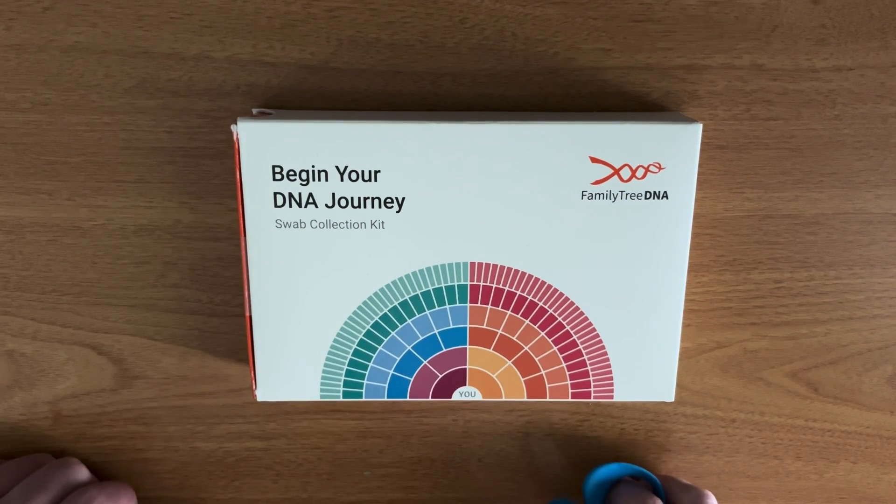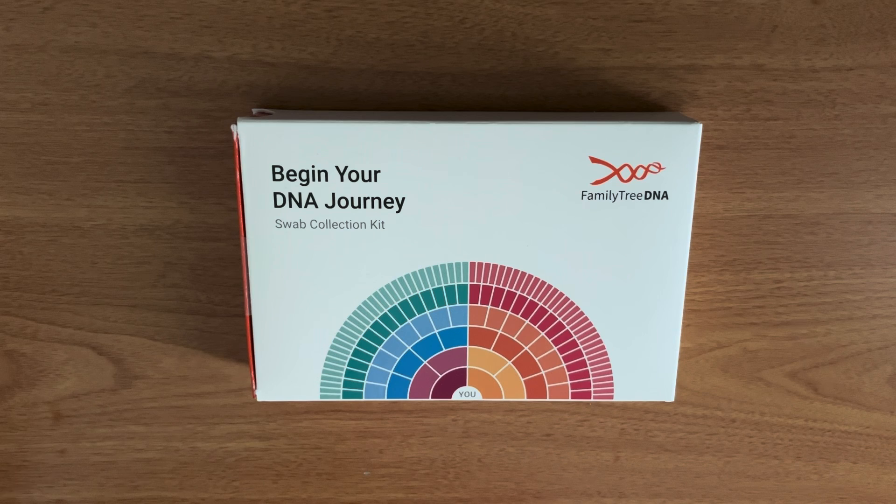I'm going to begin my DNA journey. The reason I'm doing this video is to show students in my upcoming human genetics class how to open and use the Family Tree DNA genetic testing kit.